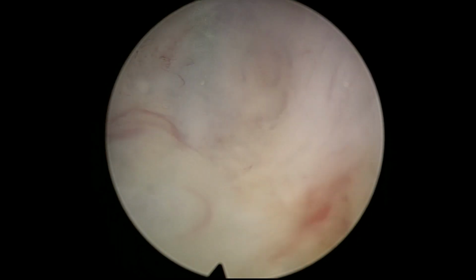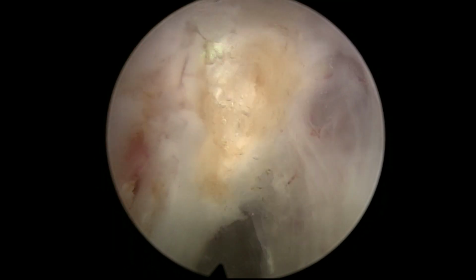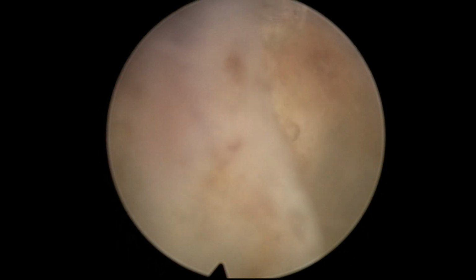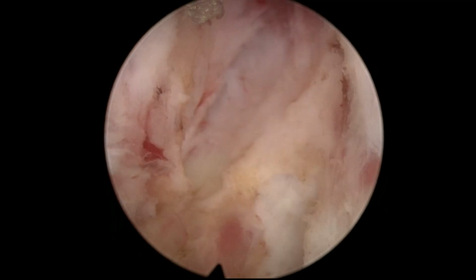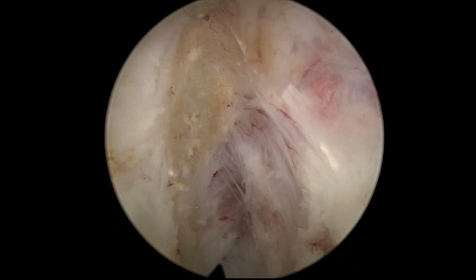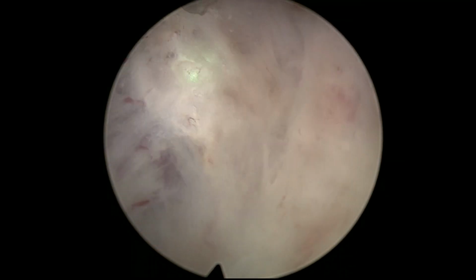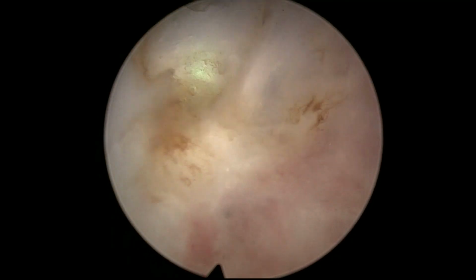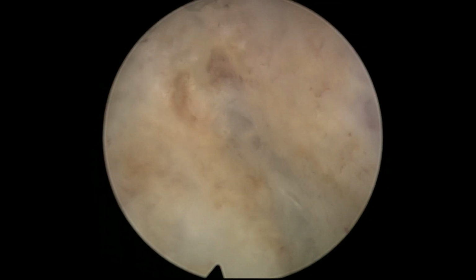So I'm going to develop a specific channel with videos of enucleations carried out with this laser, so we can all travel through this journey of enlightenment and learning where we will see different situations and different cases to see how this laser is allowing us to do endoscopic enucleation of the prostate. And then, I think after a number of cases, we will be able to start understanding what are the real differences and advantages and disadvantages.